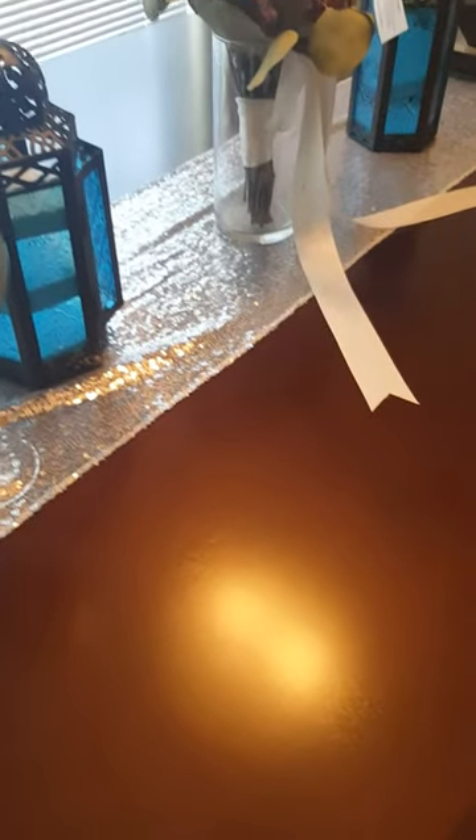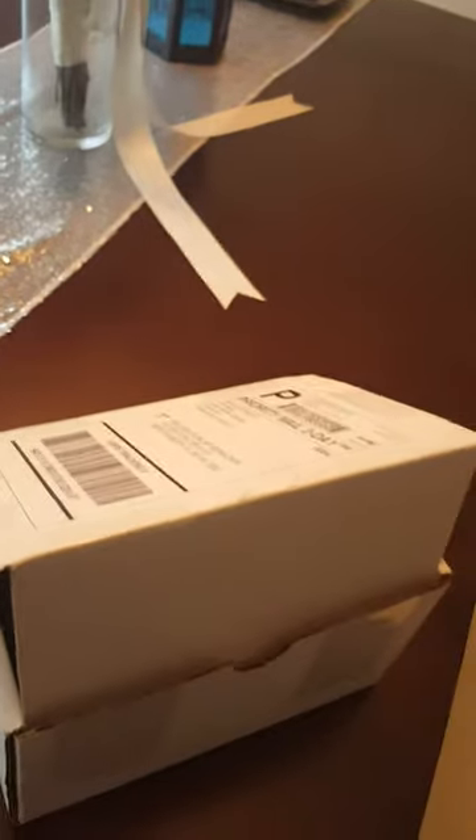I apologize that there is no one here with me so that I can actually be in this video, but I was so excited to get this. I just had to open it, so it came in really nice packaging.